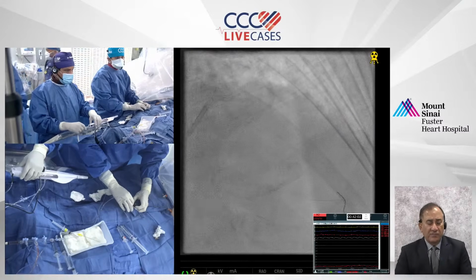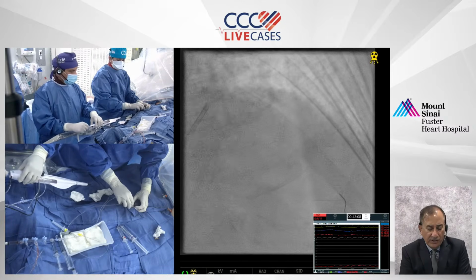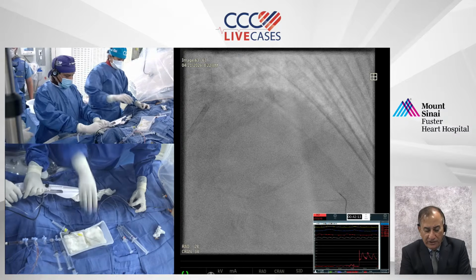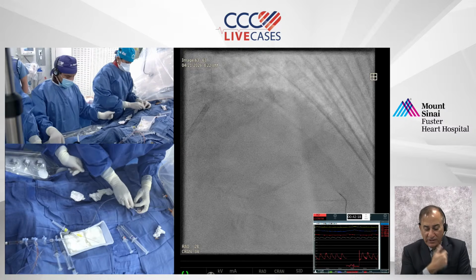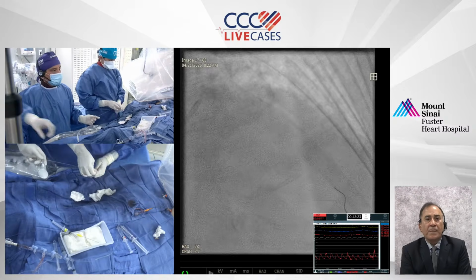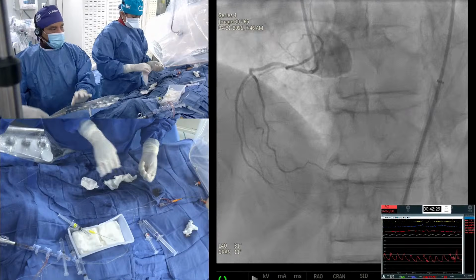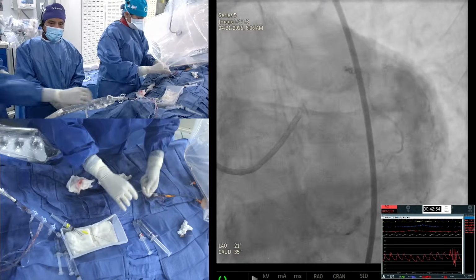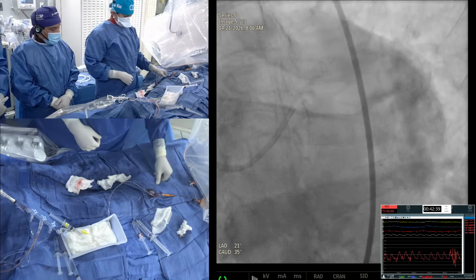Questions coming. Some very interesting ones. Dr. Syed is asking, which I'm sure is going to be the next series of questions, the strategy for stenting. And would you consider the left circumflex as the main vessel, given its size and difficult angle for recrossing? Excellent question. Absolutely. And remember, the Medina classification requires not the area subtended, but the size. From the Medina point of view, if you see the circ is bigger, so yes, the circumflex is the main vessel.